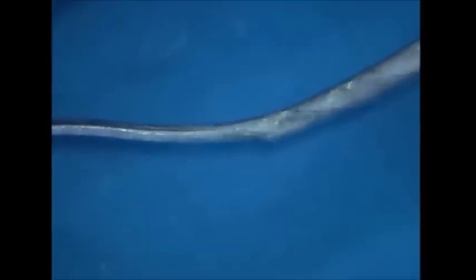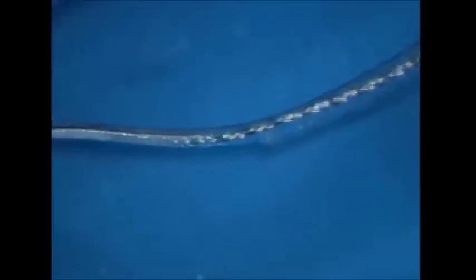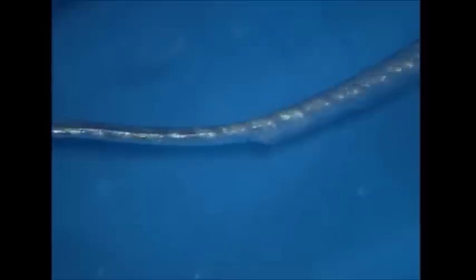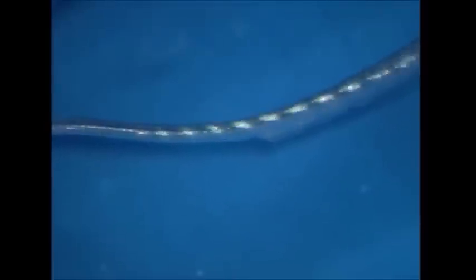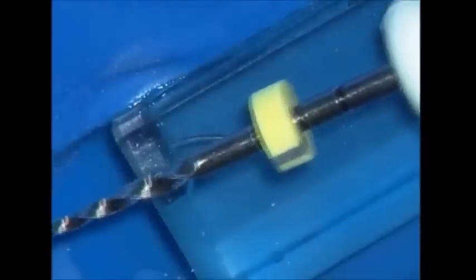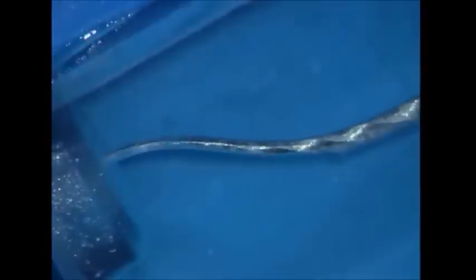Because this instrument has greater tapers as compared to an ISO O2 tapered file, a little bit of rotation on the handle draws the instrument in and begins to buff out the ledge on the outer wall. Irrigate, recapitulate, and re-irrigate to move debris into solution. To progressively manage the ledge, we use a ProTaper Shaping File 2.